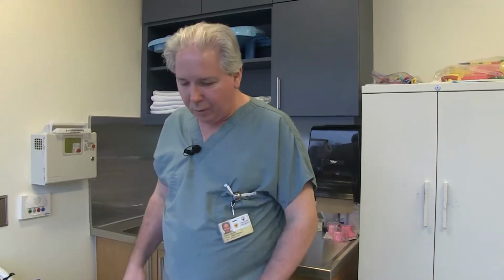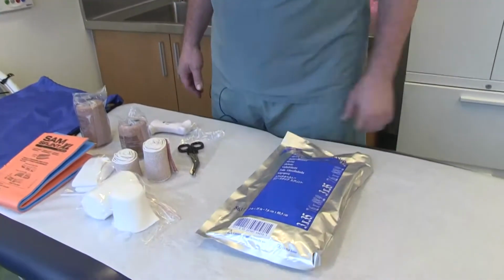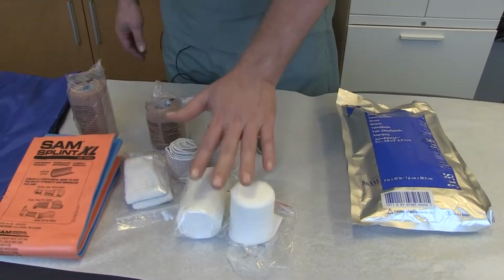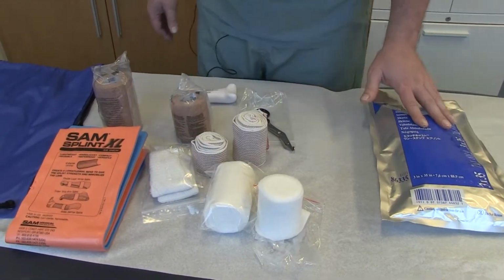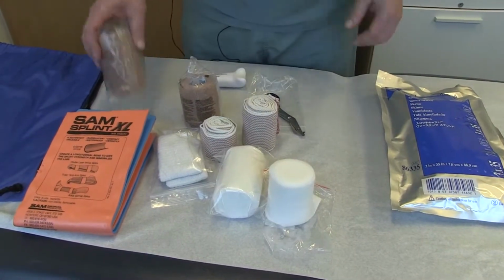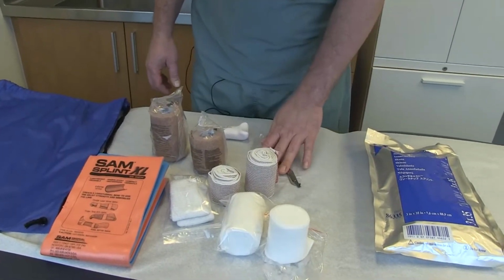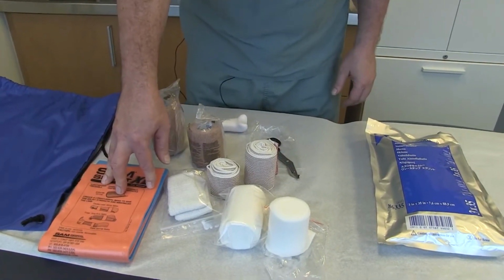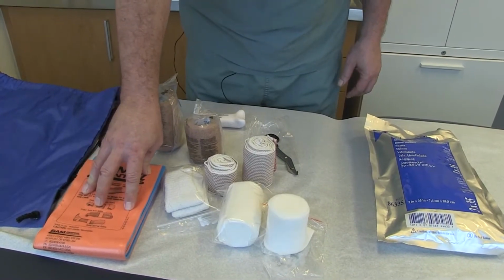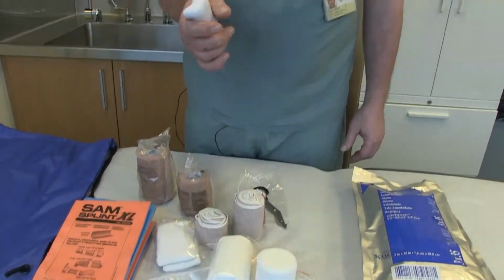The toolkit, which we will show you today, has a lot in it. So we have a 3 inches wide per 35 inches long fiberglass brace. We have orthopedic cotton wool, which we won't use in this particular case. We have elastic bandages. We have cohesive and flexible bandages. We have a pair of scissors and an aluminum brace, which we won't use either for this demonstration. There is a bone stress ball as well.